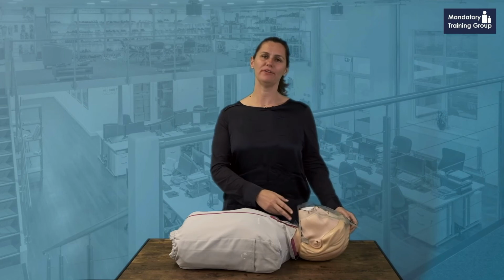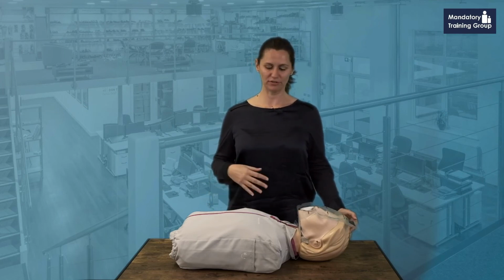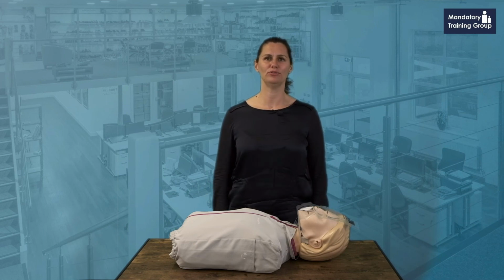After giving the rescue breaths, you would continue giving 30 chest compressions. And when you're giving the rescue breaths, you also need to make sure that you see the casualty's chest rising as well. And that's how you're going to use a face shield.